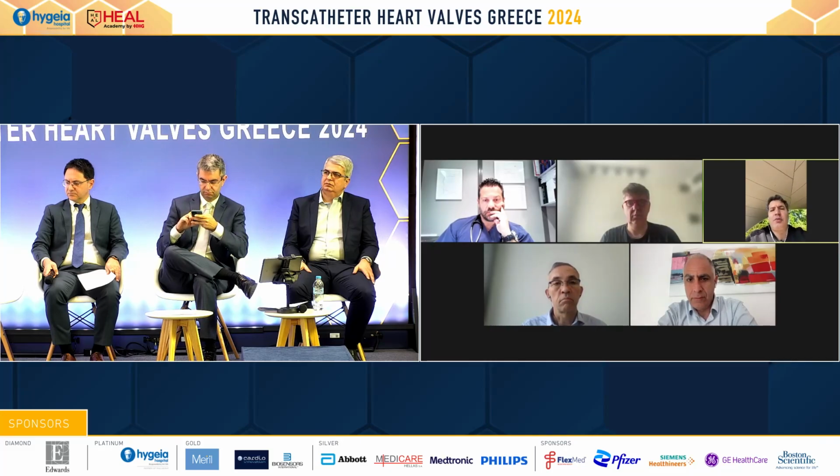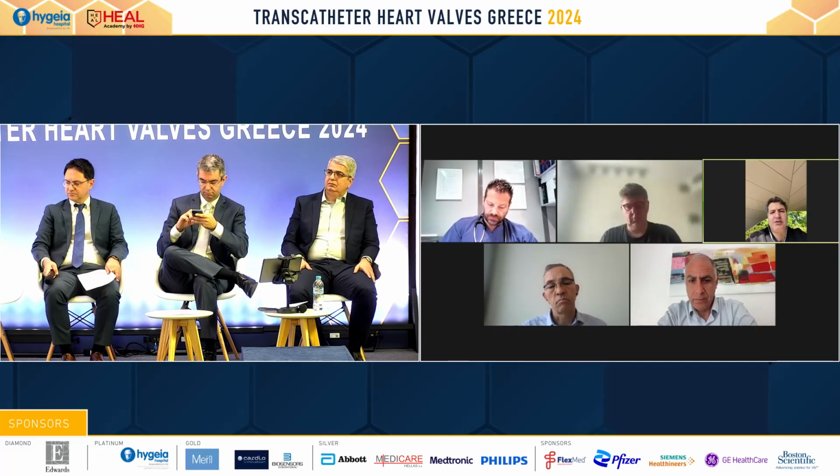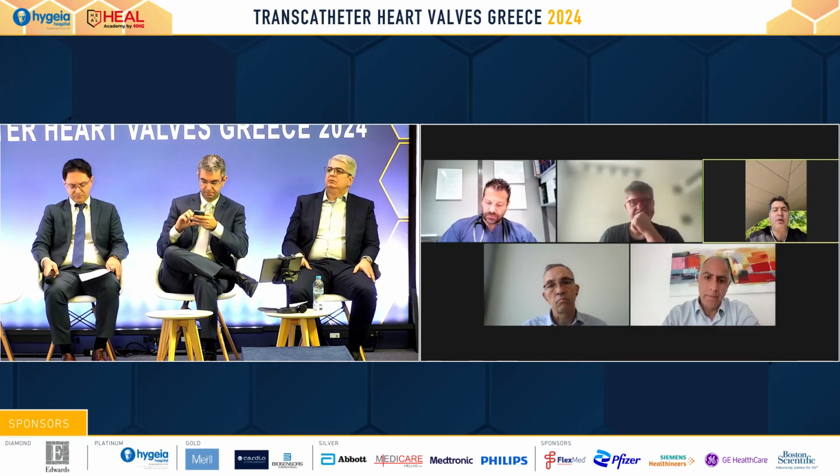Obviously, in functional mitral regurgitation or mixed disease, for example if you have a P2 prolapse but an extreme annulus dilatation, because this is a far more advanced disease in volume overload, in those cases you can opt for a complete ring. But the concept of the ring only works because you have two fixed points, trigone to trigone.